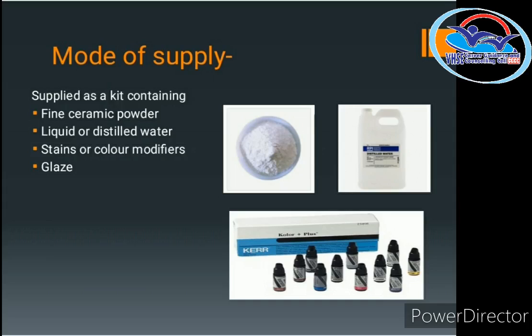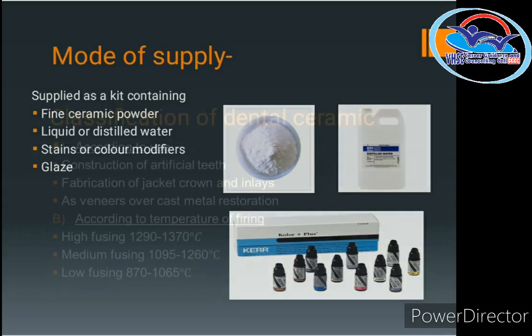Color modifiers include stains, which are used to modify the color of the ceramic. Stains are also used to make the glaze. These are used as part of the dental ceramic kit.